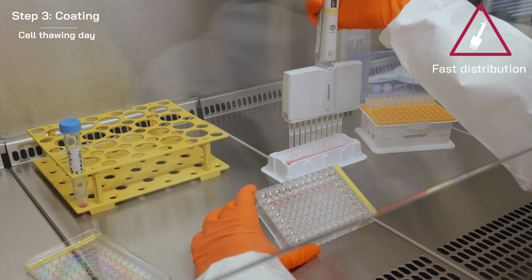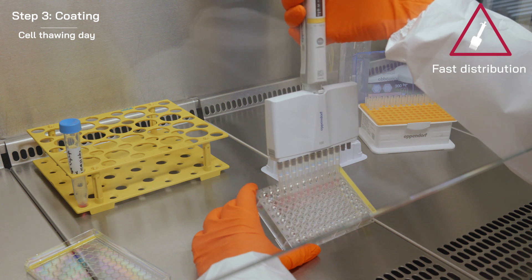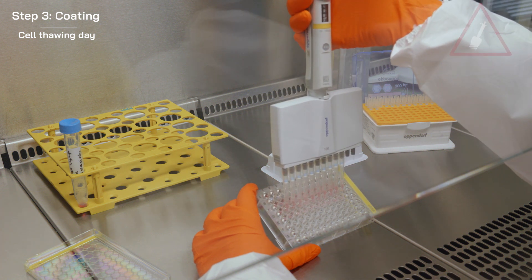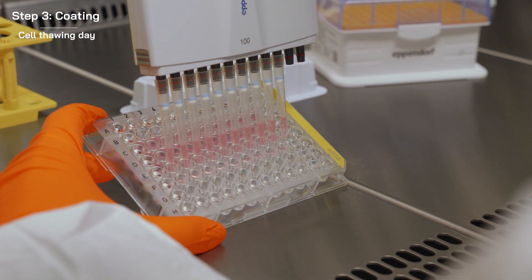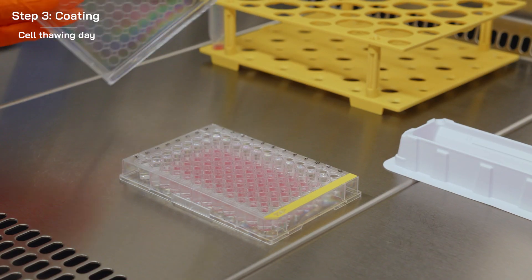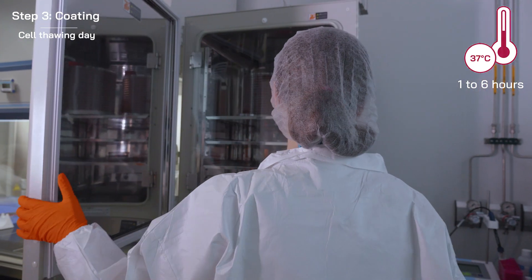Quickly dispense it into your wells. Incubate the plates at 37 degrees Celsius for 1 to 6 hours.